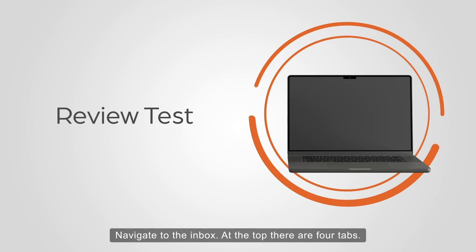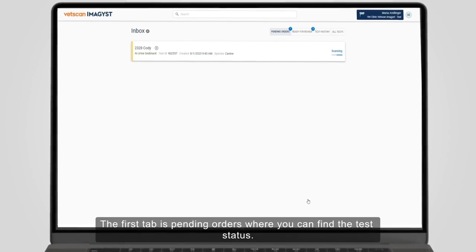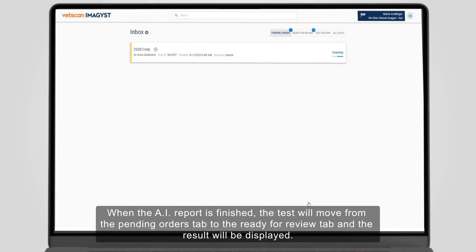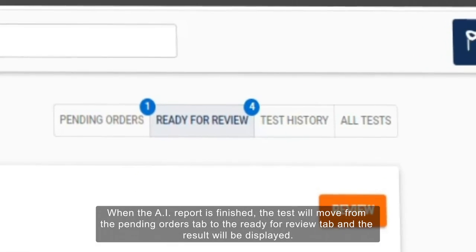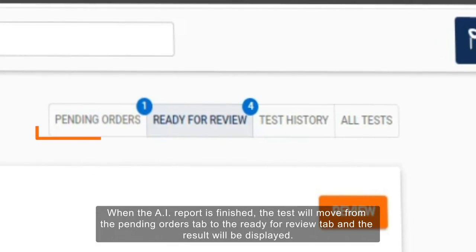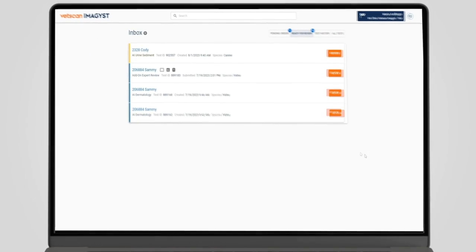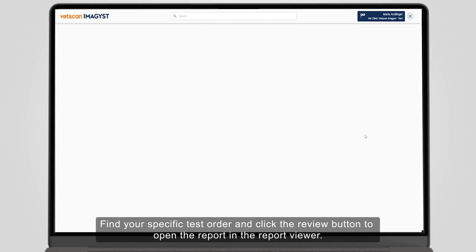Navigate to the Inbox. At the top are four tabs. The first tab is Pending Orders, where you can find the test status. When the AI report is finished, the test will move from the Pending Orders tab to the Ready for Review tab and the result will be displayed. Find your specific test order and click the Review button to open the report in the report viewer.